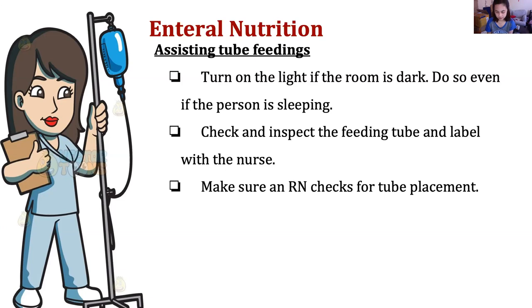Make sure an RN checks for tube placement. Okay? Tube placement. Actually, the registered nurse only has the responsibility to check this unless you have training to do so. Okay, how will we check the patency or the tube placement?